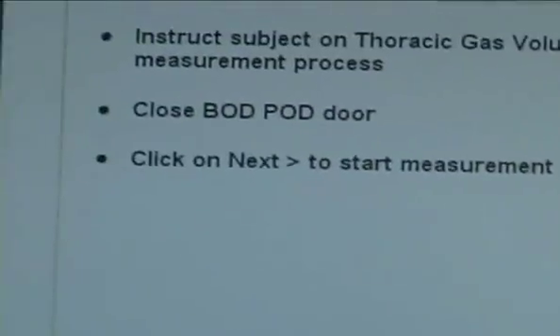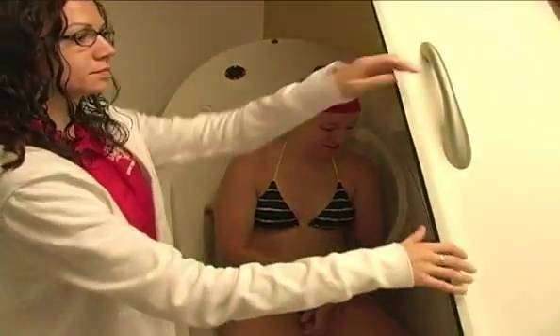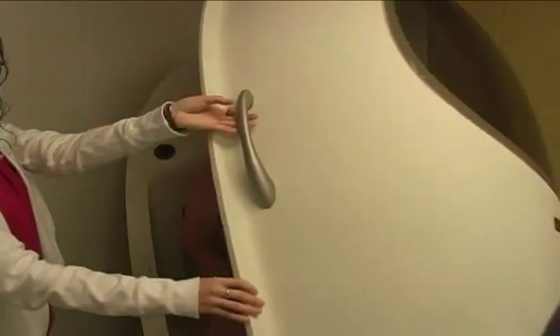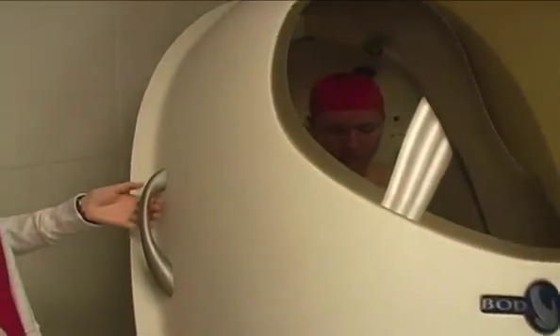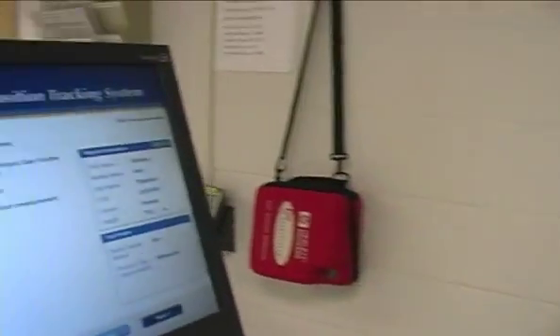And we'll turn this. Okay. Any questions about it? Okay. So let's try it again. Maintain that tight seal.